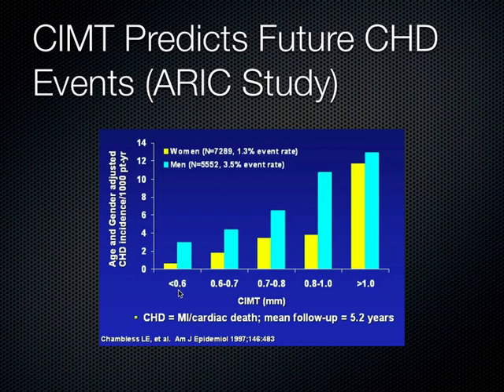So it's not surprising when you start to think about it, as that carotid intimal medial thickness gets larger and larger, the odds of having a heart attack or dying from cardiac death go up as we go here. And so I think this is one way to help show your patients right there at the bedside that they really should be taking their antihypertensives and also their anti-cholesterol drugs, because I think showing them their intimal medial thickness and a graph like this will help them be more compliant with those types of medications.